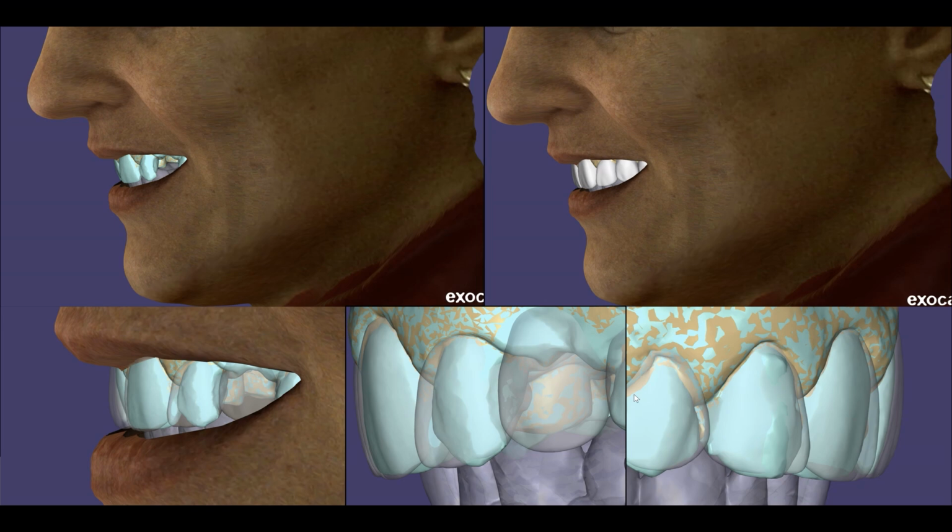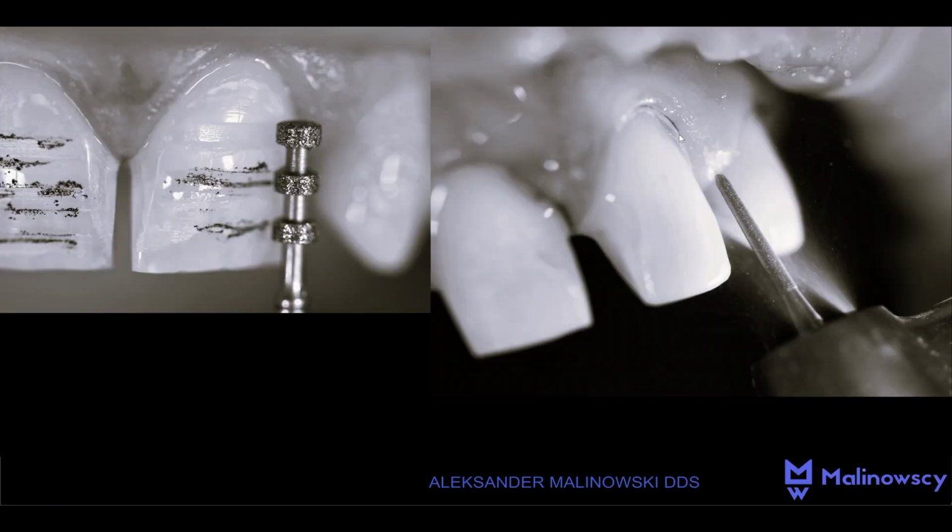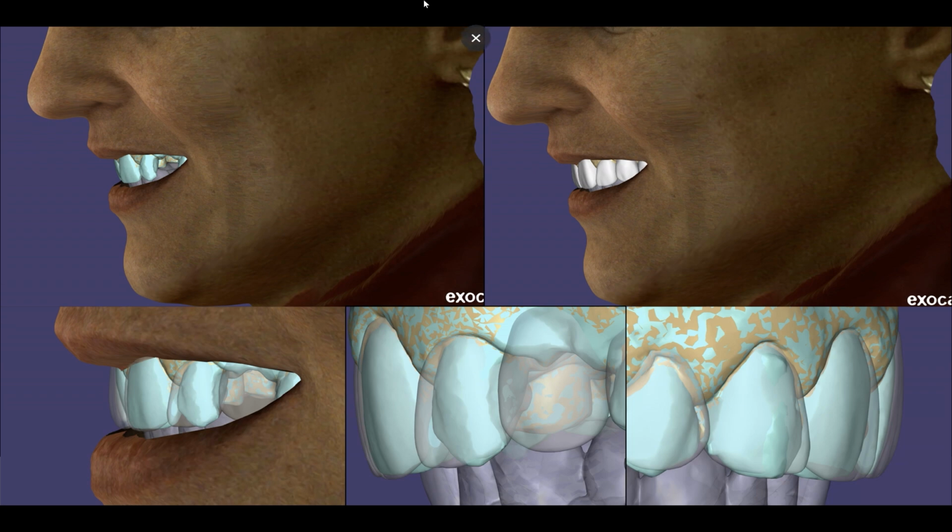Technicians tend to overbuild the arches and the profile of the incisal tooth, which can create the impression of barrel-shaped teeth. The ability to analyze the shape of the prosthetic work design not only from the front but also from the profile allows us to avoid the usual hesitation about whether the teeth will be too protruding and to adjust the preparation to the aesthetic conditions.